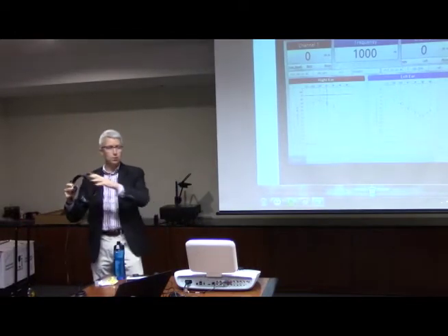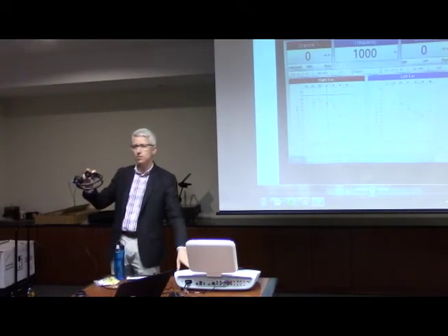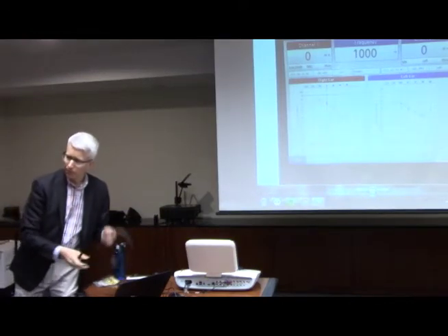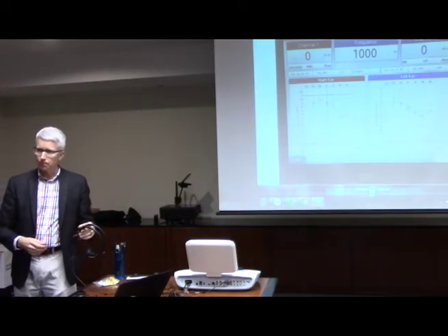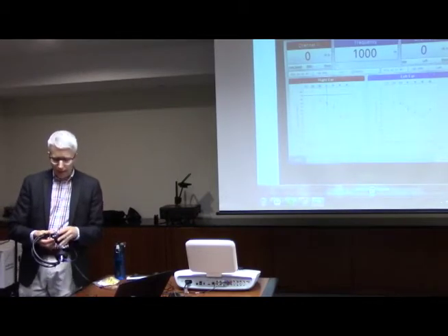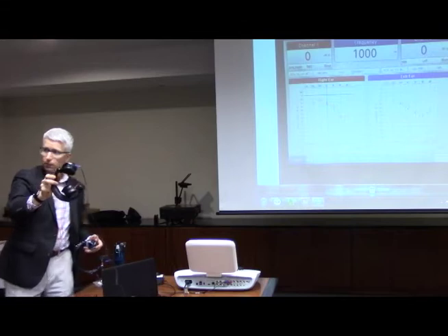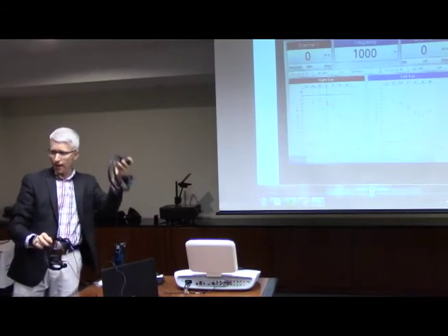So if I unplug these, plugged in a different set, I would then have to recalibrate because it's a different transducer, and I need to make sure it's still correct. Can I answer that question? Yeah, so if you unplug that one and plug in a different one, and then replug this one in another time, so you unplug the second one and put the first one back in, does it still have to be calibrated again? Yes. So like I've got another set over here. If I plug this set in and brought Chuck in and he calibrated, and then I plug this one back in, I would have to recalibrate it back to this one.